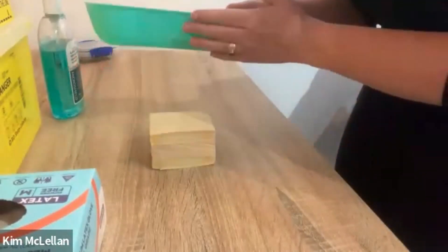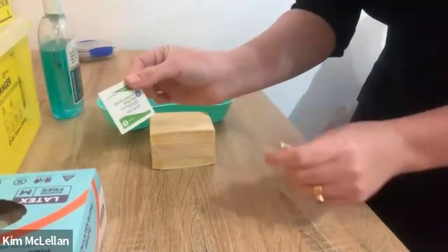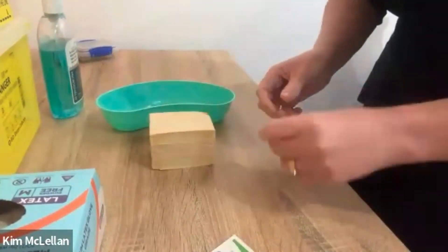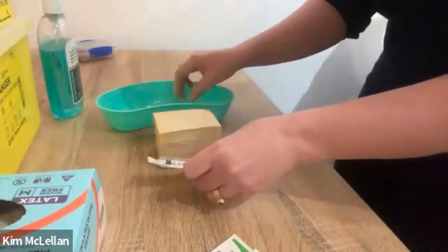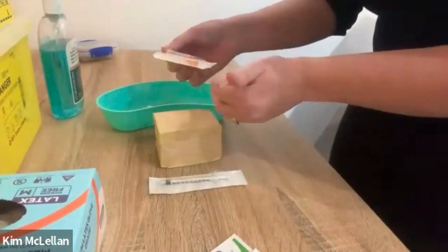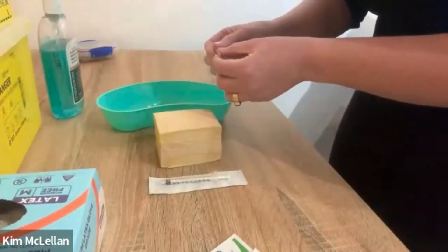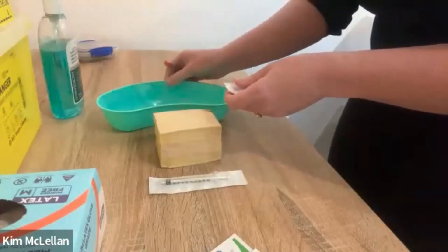First of all, we need to have our kidney dish, we need to have an alcohol swab, and we need to have a syringe — a subcut syringe and some needles. One needle for drawing up and one needle for administering the medication, and of course we need to have our medication.